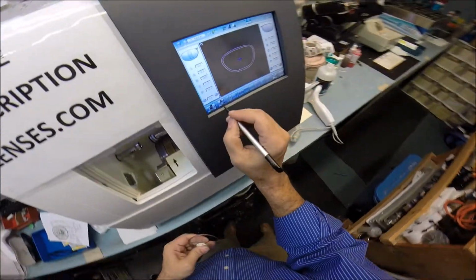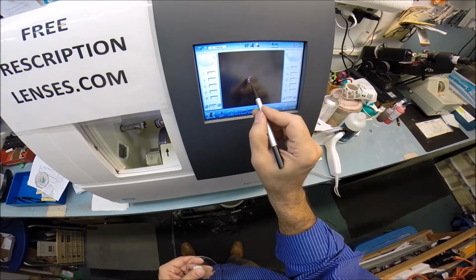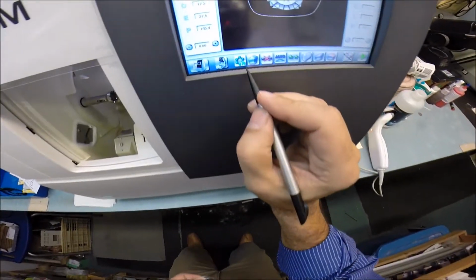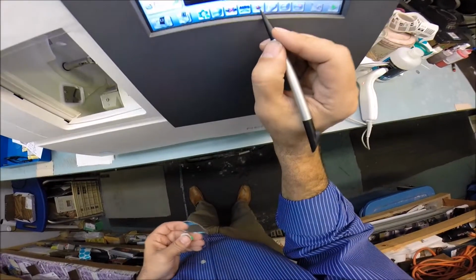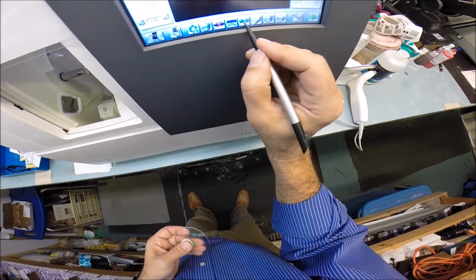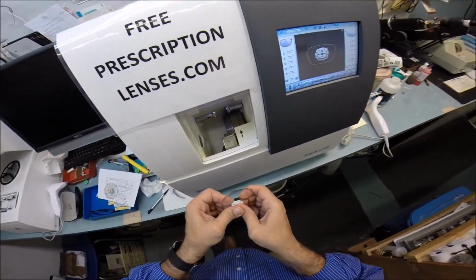Now, I hit this button. This is the shape of the left lens I cut for Caroline in Lafayette, Louisiana. I hit the button, and this is now going to bring your shape over to the computer. These are polycarbonate lenses. If you see PC, the 2 stars indicate that it's cutting on the soft cycle because of the anti-glare. 1 star in red means it is no anti-glare. Hit it again, we have 2 stars. This button would polish the lens, but I do not want to polish your lenses because of the anti-glare coating.